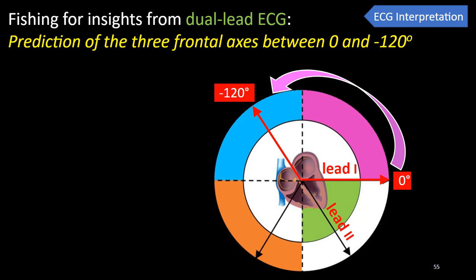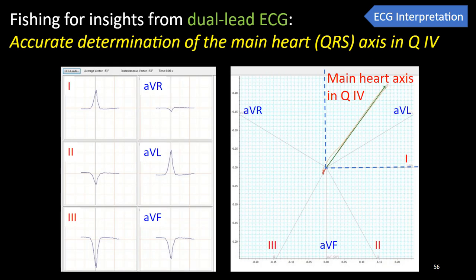Using Einthoven's triangle, we can precisely define the three frontal electrical heart axes by painstakingly calculating the vector sum of the two vector projections in leads 1 and 2 manually, or we can do this rapidly and automatically with LabChart software. Now, just as in humans, fish QRS is also the largest of the three ECG waveforms, therefore fish QRS axis also determines fish main heart axis.